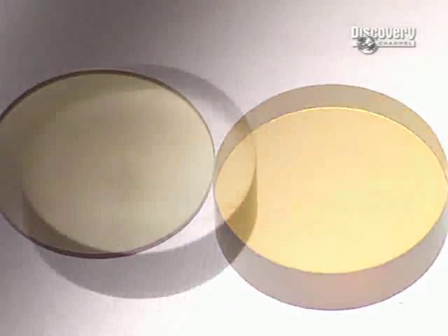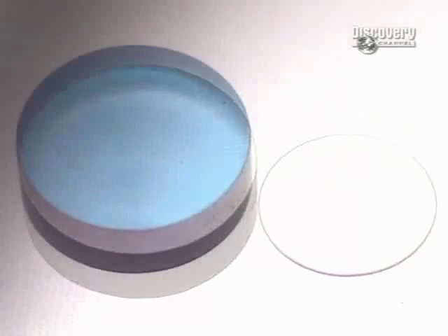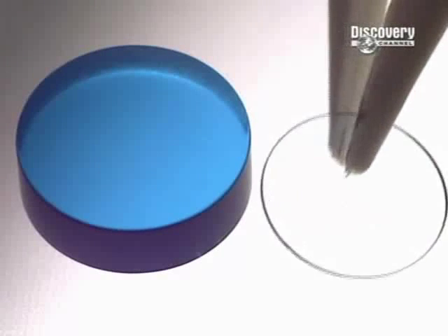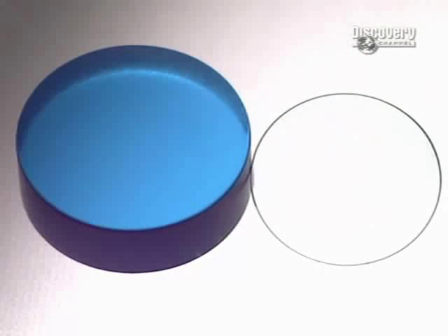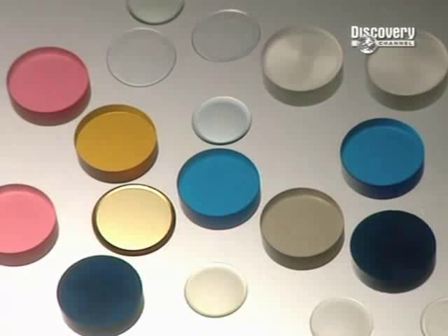Although the production of a lens involves 14 steps, if you exclude the hydration process, it only takes 15 minutes to make one. From these simple coloured discs, a crafted precision piece of technology can transform a person's life instantly.